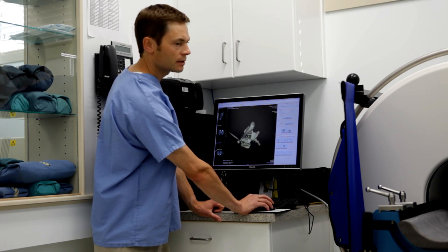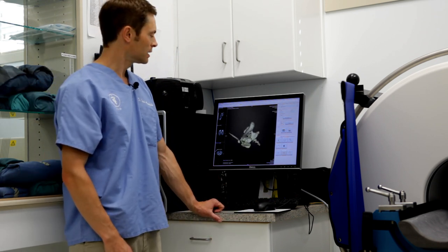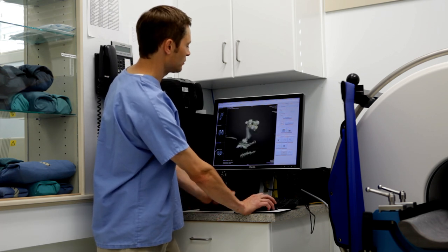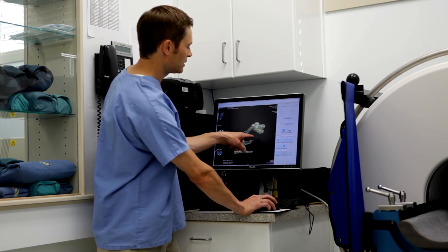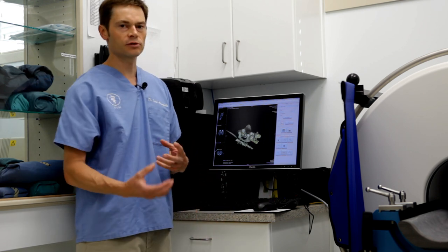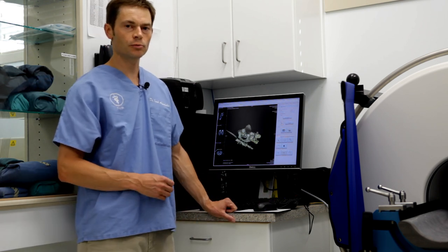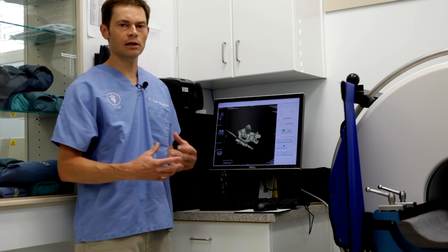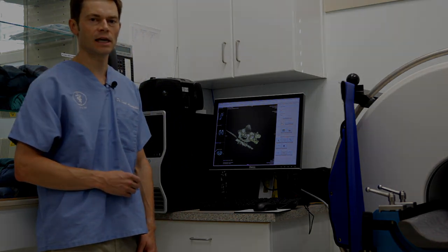The CT scan was very helpful in identifying the pieces and what size of screws and plates were required to put it back together, and so it allows a very good surgical outcome in the end.